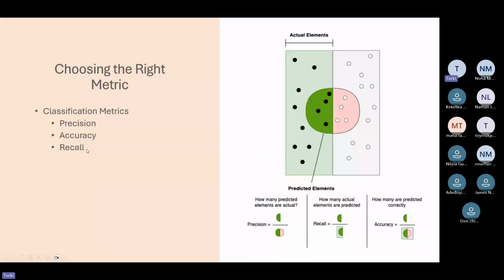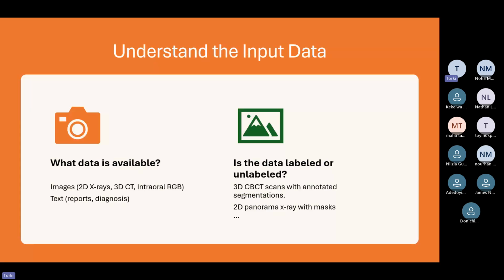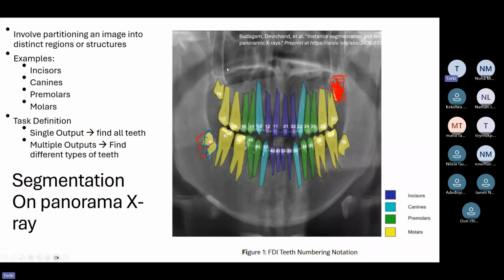Other metrics are usually used for classification. Some papers report accuracy for semantic segmentation, but I find this very odd because it is very usual to get very high numbers for accuracy. Accuracy means your label is matching the ground truth label. But for example, in this image, we have too much background class, right?